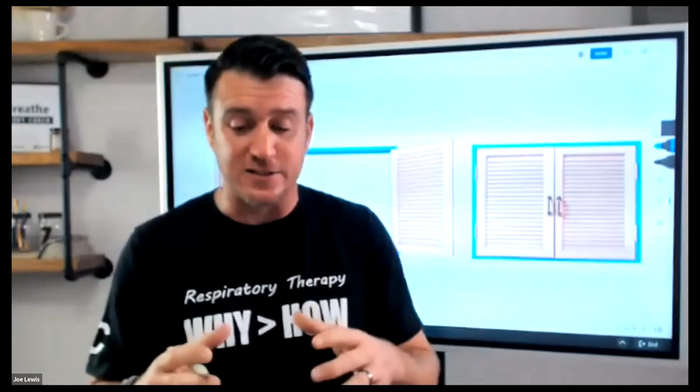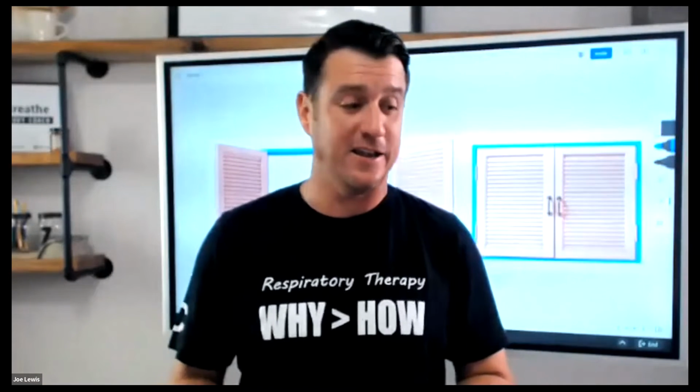Recruitment maneuvers, a lot of data supporting recruitment maneuvers. Now, there's no superior one that says this is the best recruitment maneuver, but there are lots of mechanisms out there talking about recruitment maneuvers. There's also the use of esophageal pressure monitoring, which shows that we can illustrate when pressures are excessive by utilizing esophageal monitoring devices.